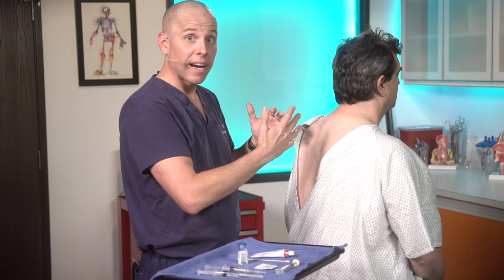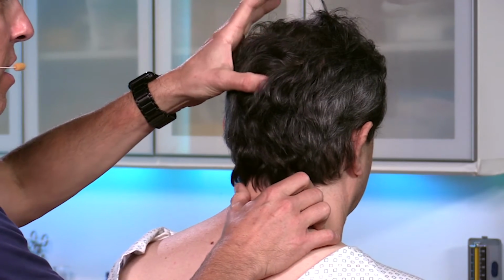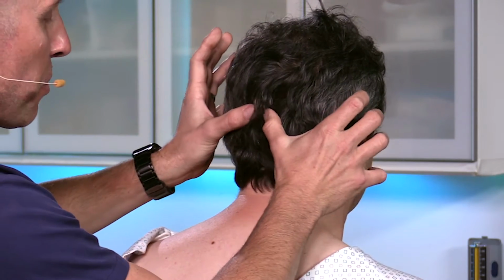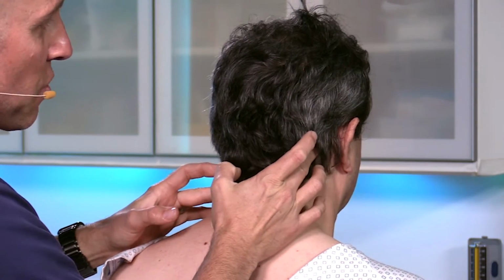So let's go back to reviewing our anatomy, the stuff that I showed you on the model. I'm going to go over it again on our live patient. So you're going to find your occipital protuberance. That's that bump at the top right here. You can feel sometimes that occipital ridge that cruises down from it, and then your mastoid process right here.